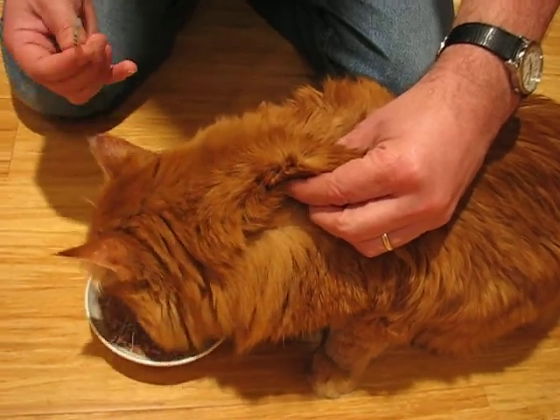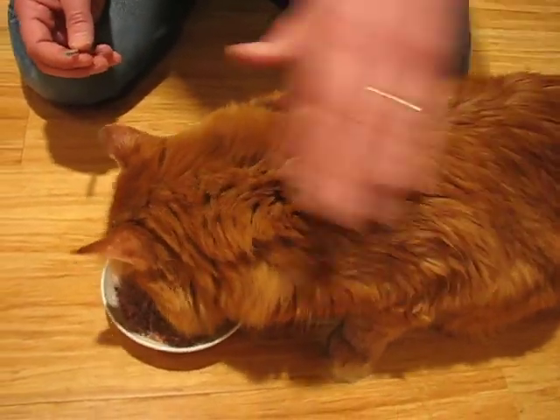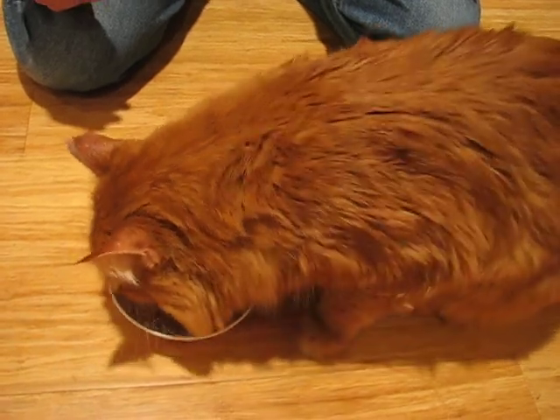There are different spots you can inject your cat, but this is what works for us. And that was it — it's easy.